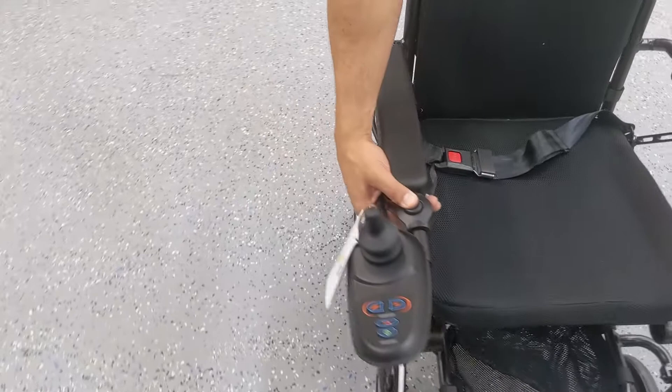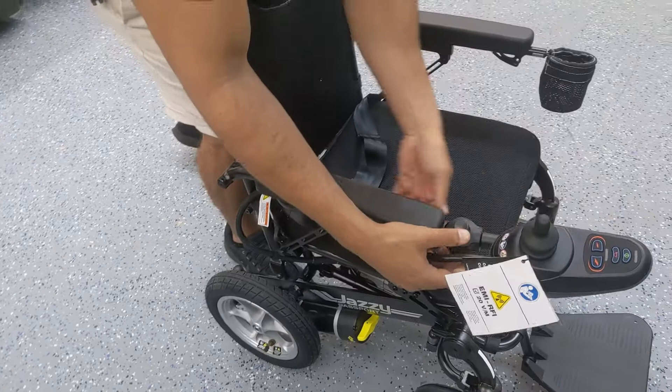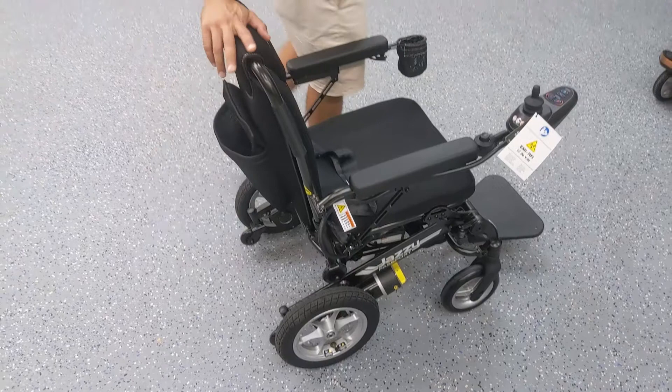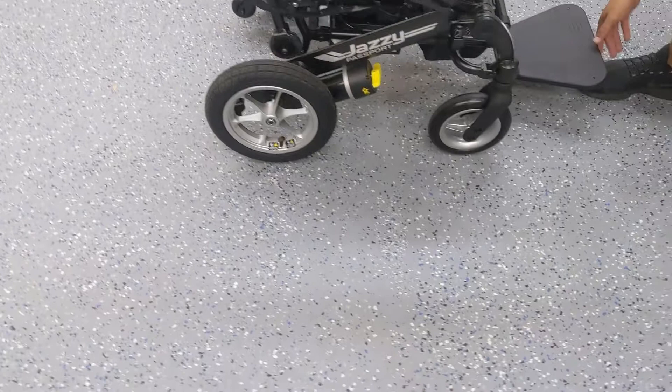There is a nice feature on the joystick mount. If you push that button down you can control the position a little more, and you can also rotate it when you loosen up that bicycle-style clamp. So in terms of positions, you can really control the placement of that joystick, giving the user the most comfortable setup possible.